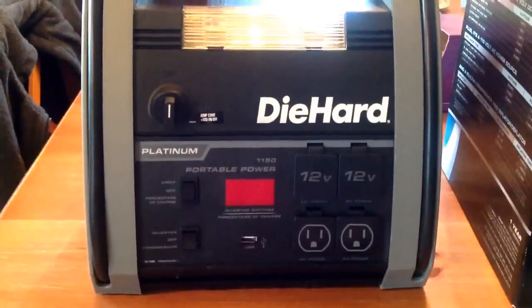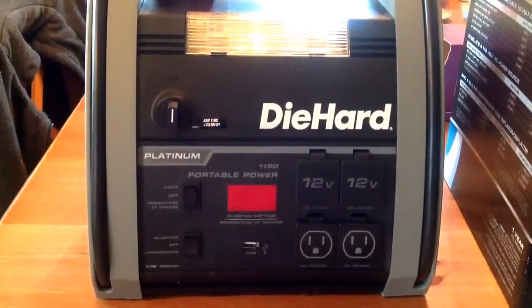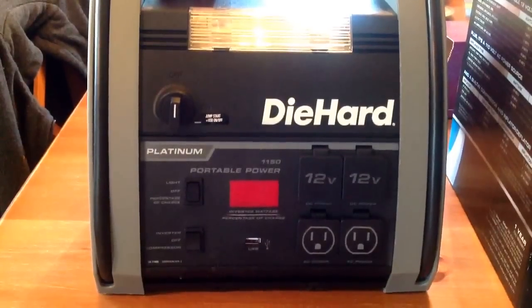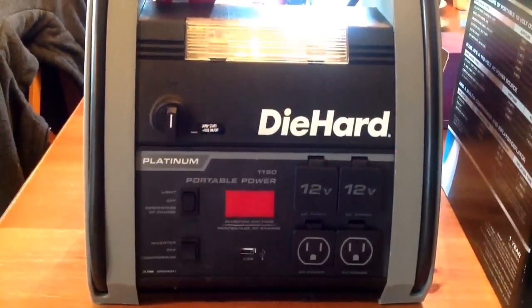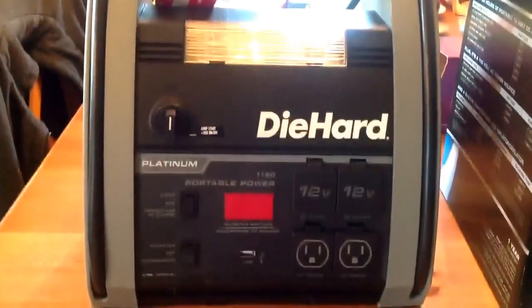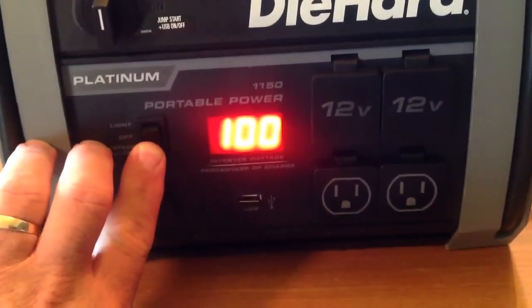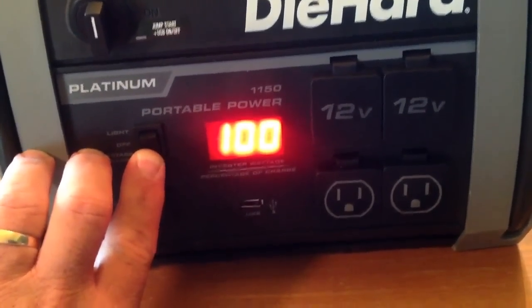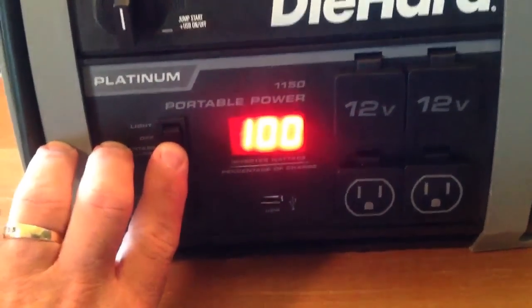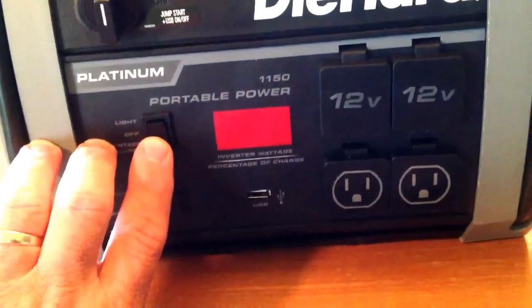Now, this is my second one of these devices, and I know a lot of people have had problems with these devices. If the battery gets too low, you'll kill the battery, so you've got to keep it charged. But what happens when you buy it off the shelf and it's just sitting there? Well, the first device I had, if I put this on to see how much it's charged, I noticed it didn't go past 97%. But when I unplugged the extension cord from the wall, then it went to 100%. Well, that's kind of odd. Why would it say 90%?